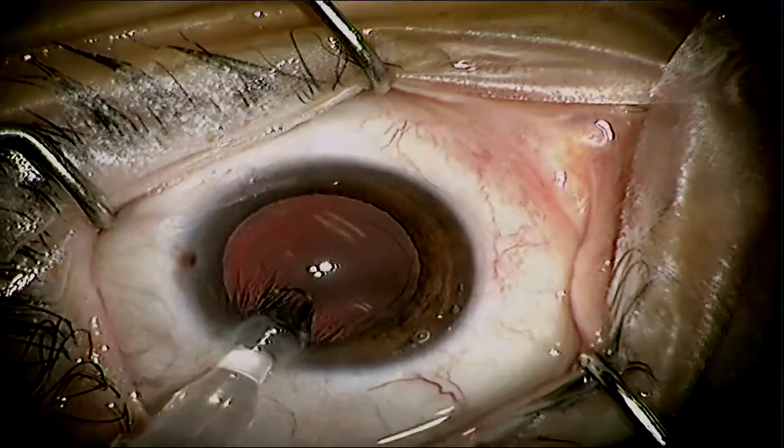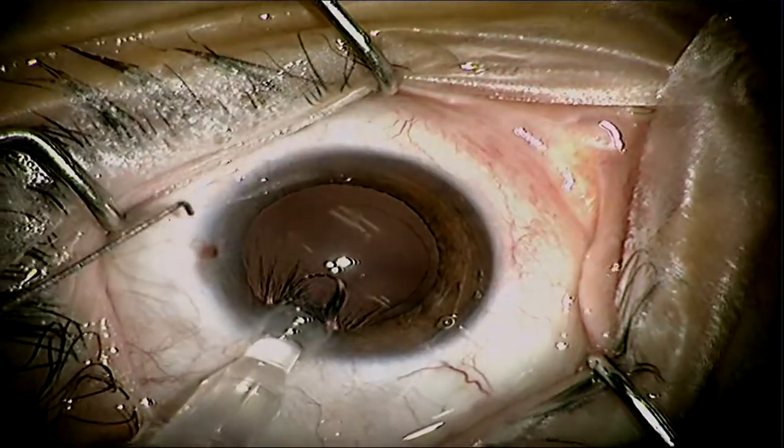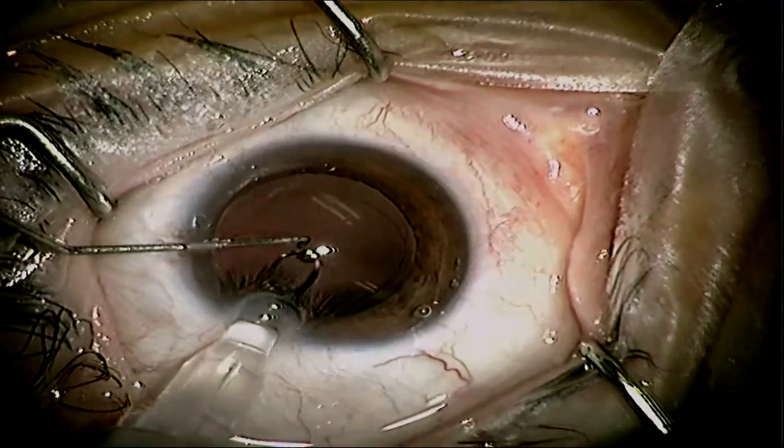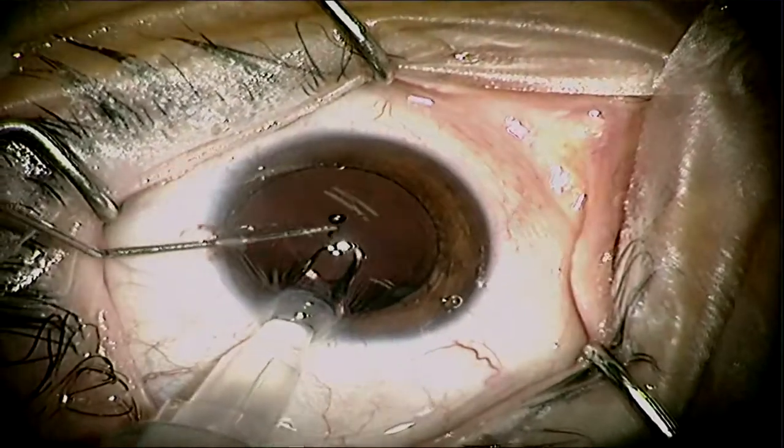It is an injector style, so once you have the injector in, you try to aim for the middle. The haptics do come out quite quickly, so you do want to make sure there's enough room.